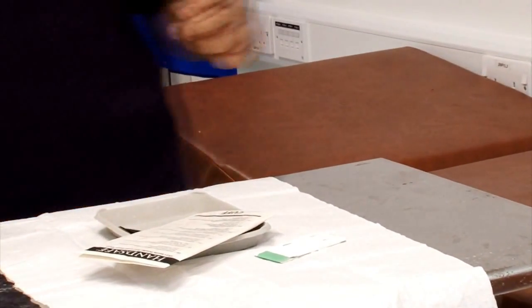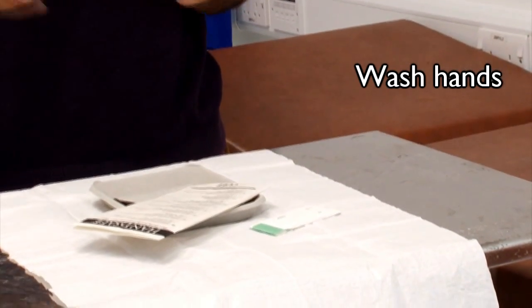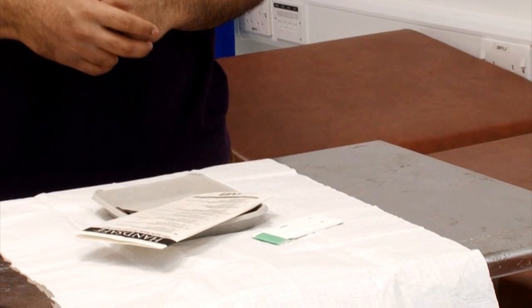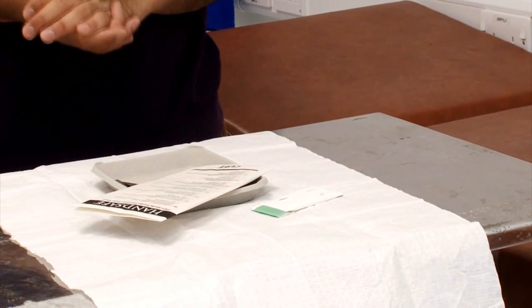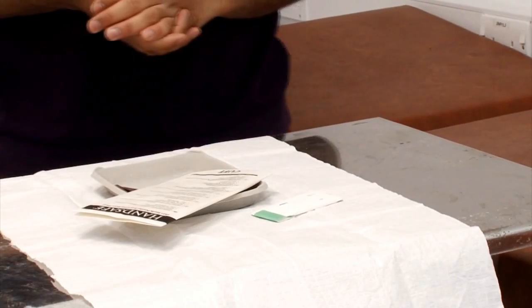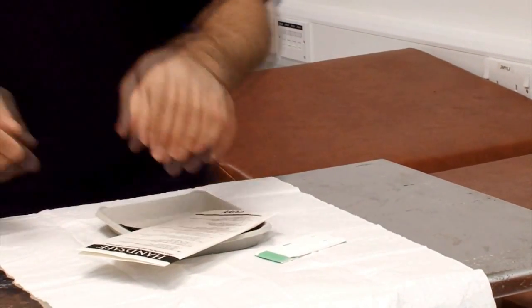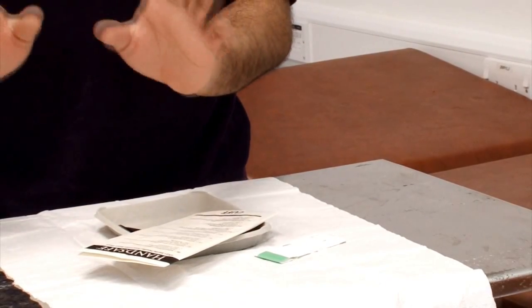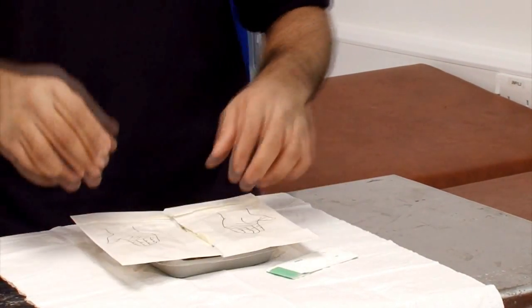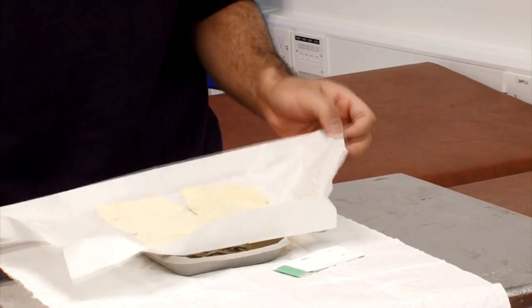After this, you should move on to wash your hands — wash with soap and water from your wrist up to around here. Then you're ready to put the sterile gloves on and move on to the suturing itself. After washing my hands with soap and water, I'm free to touch this area now, but I still try to keep contact minimal.